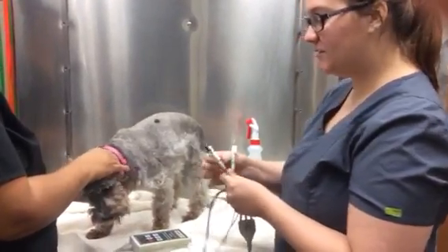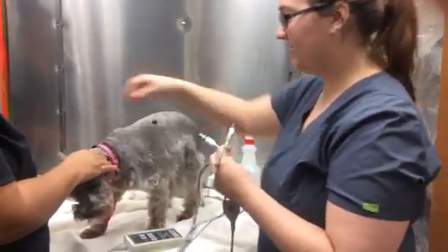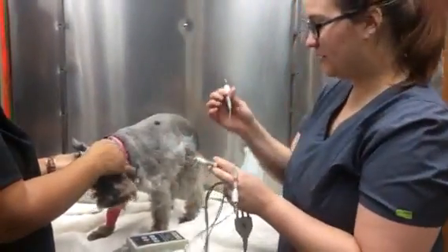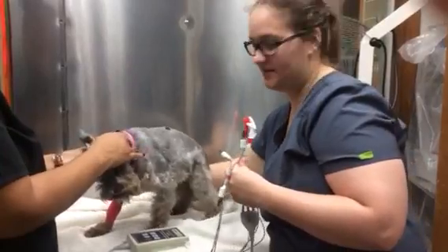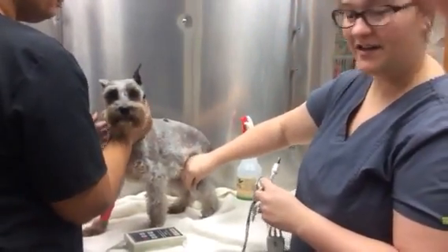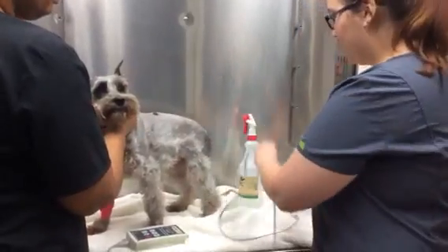Okay, it's an EKG, so the white one goes on the right, the green one goes on the back right, and then the red one goes on the left back. A couple white alcohol wipes.